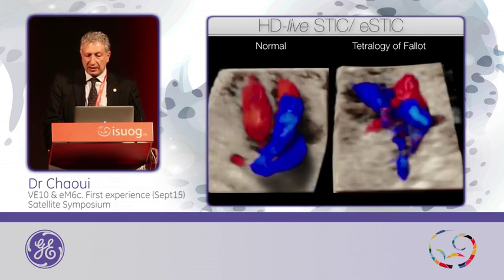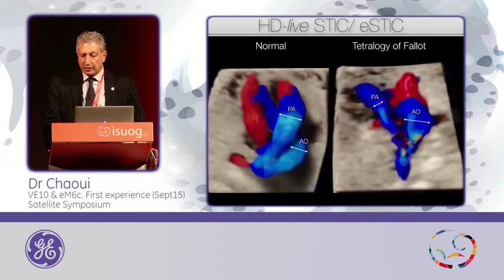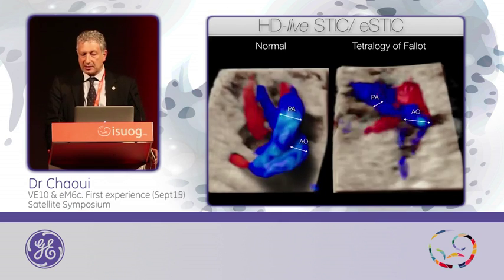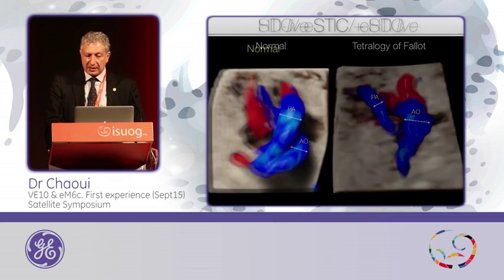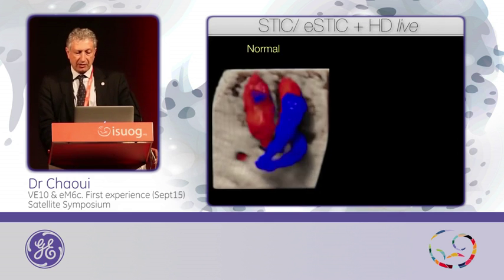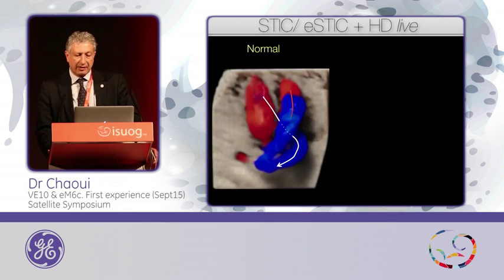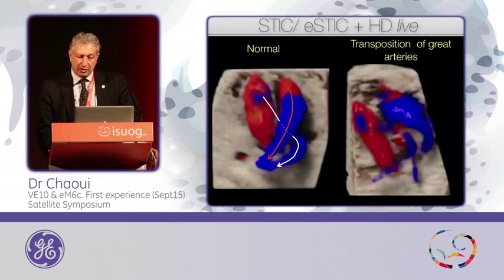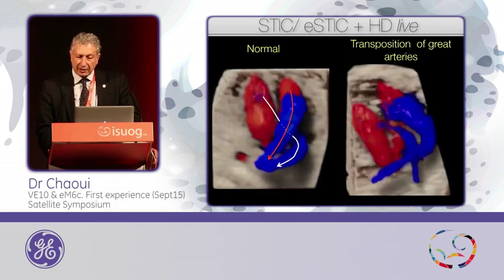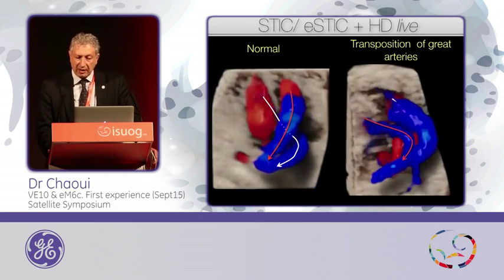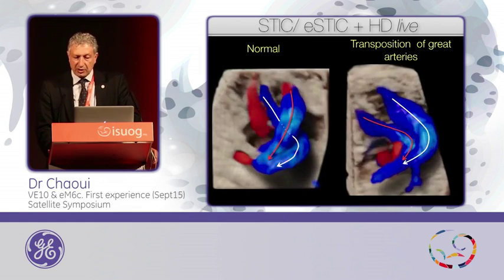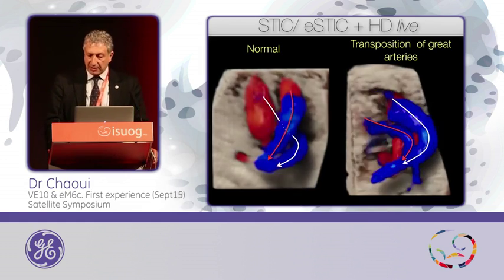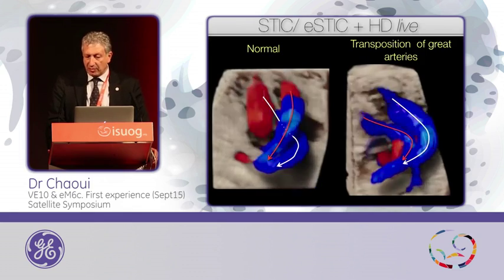And this is a clinical case of a tetralogy of Fallot where you recognize the narrow pulmonary artery in comparison to the dilated aorta. Or in this case, focusing on the vessels, the aorta arising and the pulmonary artery crossing over it — in comparison to a transposition of the great arteries, where both vessels have a parallel course to each other, the pulmonary artery arising from the left ventricle, and you see even the bifurcation.